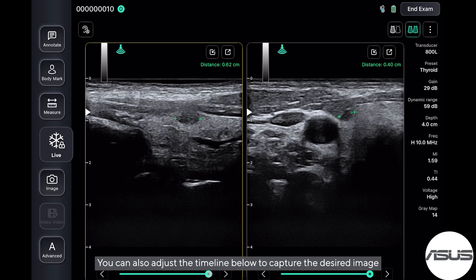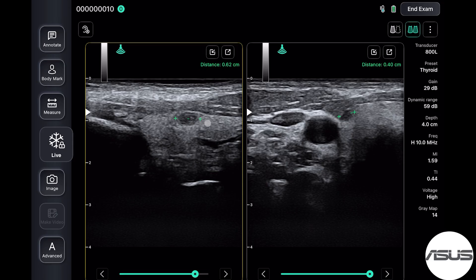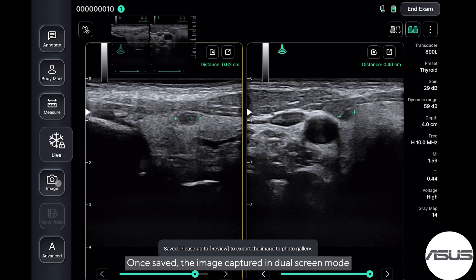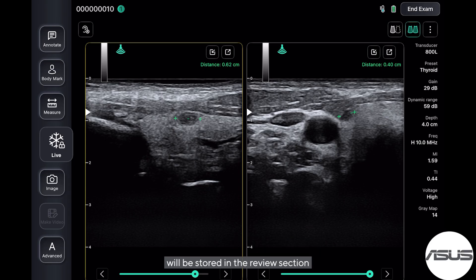You can also adjust the timeline below to capture the desired image. Once saved, the image captured in dual screen mode will be stored in the review section.